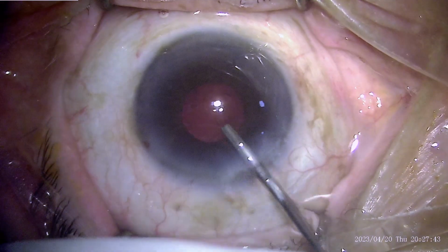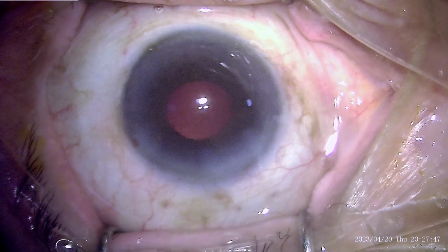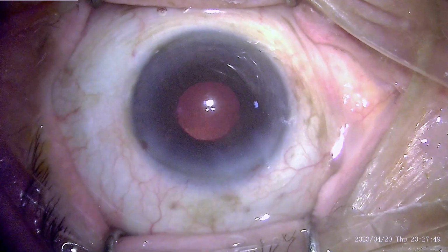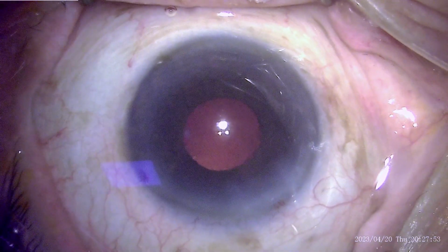Every possible break should be used to replenish the viscoelastic gel, which will provide good coating and protection to the corneal endothelium and keep the chamber formed.